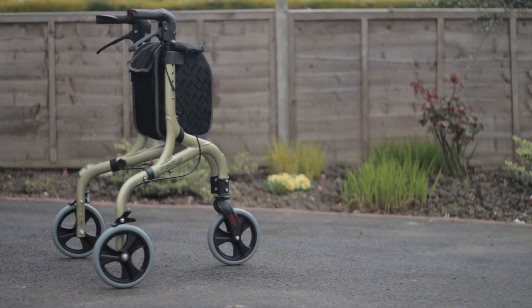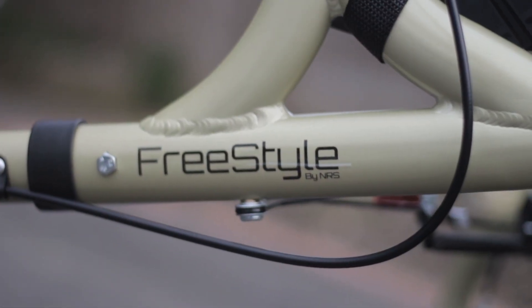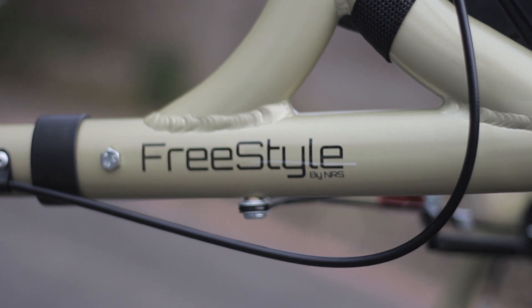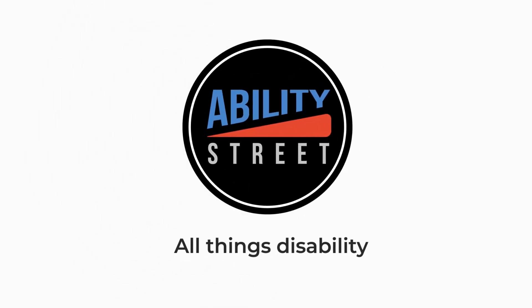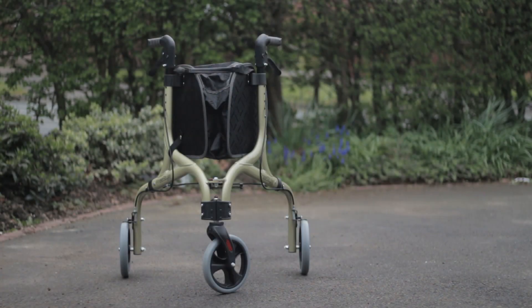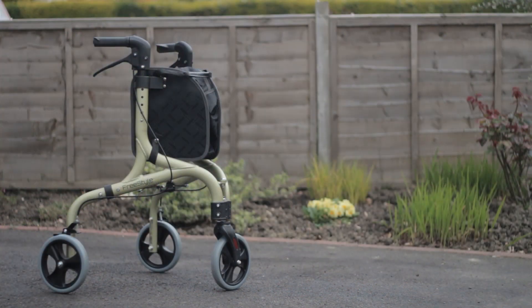In this video I will be taking a look at the Freestyle Rollator by NRS Healthcare. The Freestyle Rollator is a lightweight walking aid used for people who need a little extra assistance walking.